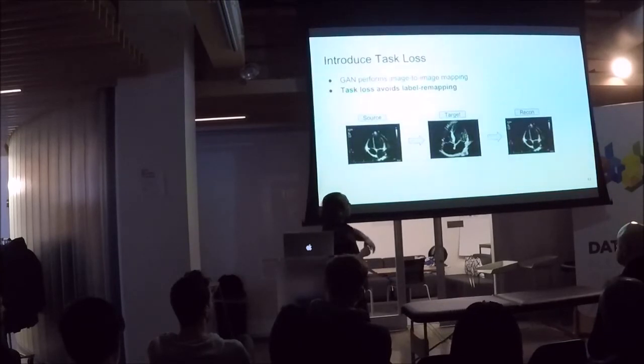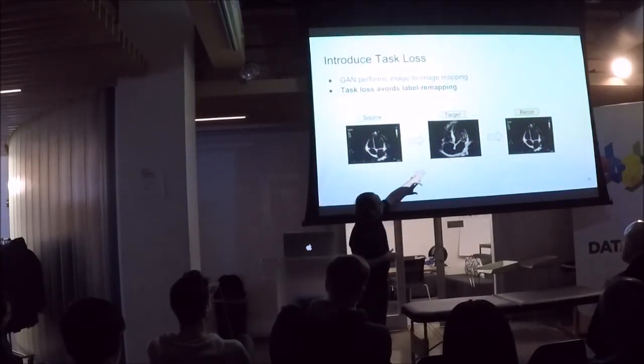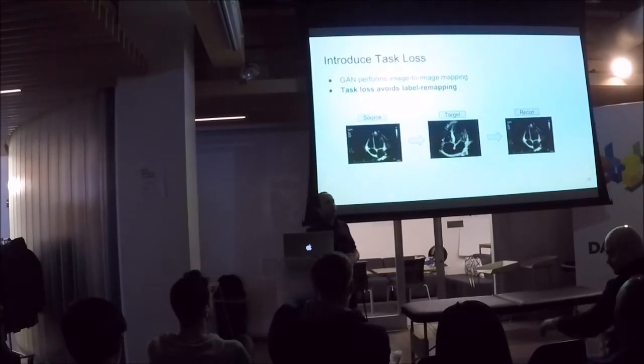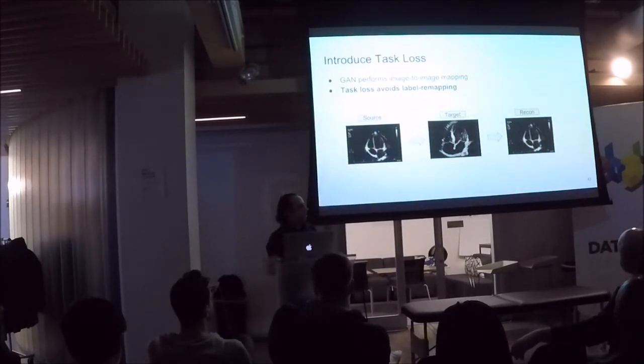Now you'll have to just believe me that this looks like a butterfly image, but I think everyone can see that these are not the same heart, right? There's clearly something very different about it. So even the inclusion of a task loss that is a classification may not catch all the artifacts that we might be worried about.